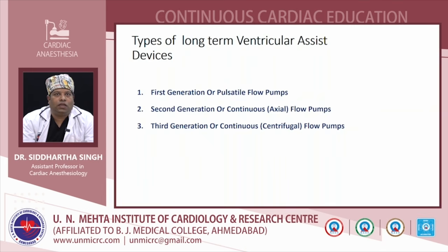Now coming to the long-term ventricular assist devices. There are three generations. The first generation was the pulsatile blood flow type. The second generation is the continuous axial flow type, and the third generation is the continuous centrifugal blood flow type.